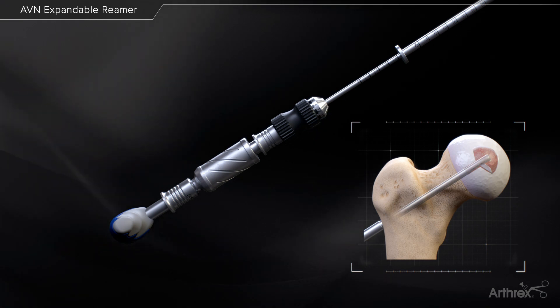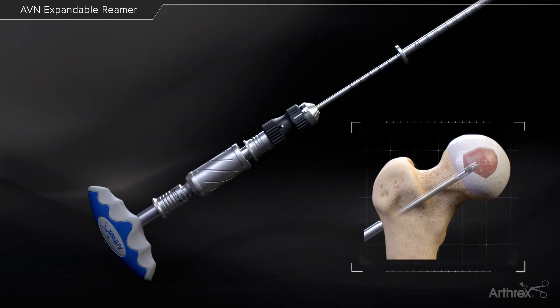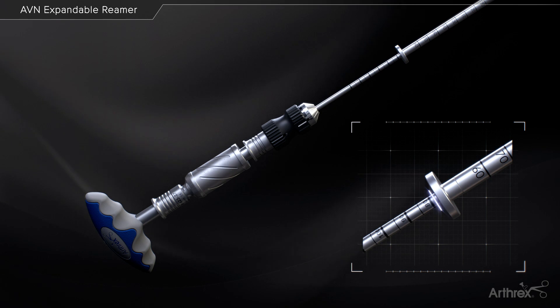Once the blade is expanded enough to decompress the lesion, pull backwards while rotating the handle to create a longer socket. The socket depth can be referenced off the 5 mm drill sleeve.